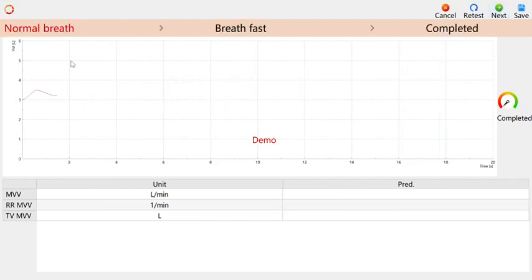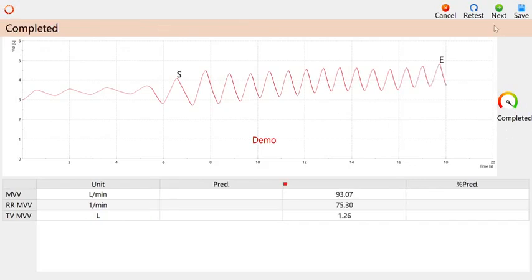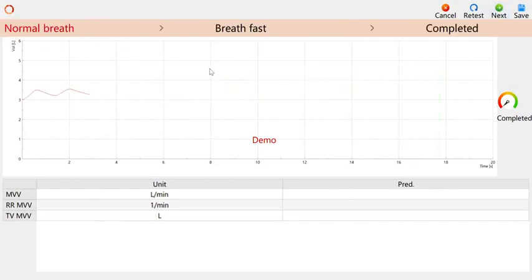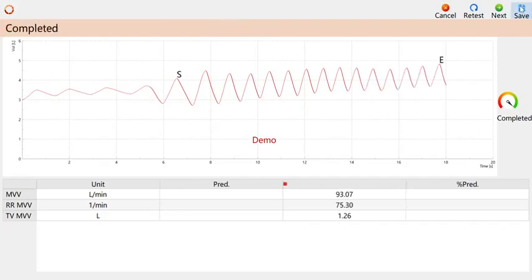Click Next to conduct the second test and repeat the first test process. After the test is completed, click Next to continue the test. MVV can be tested twice, up to 8 times. You can also click Save to finish the test.